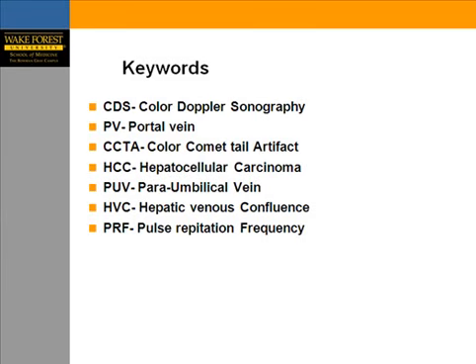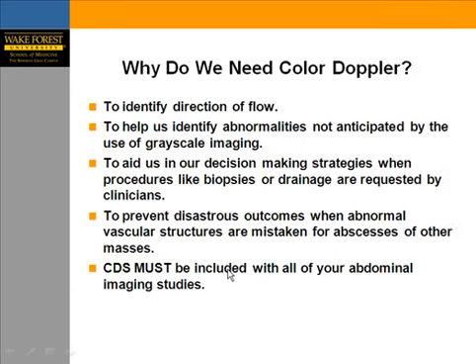All right, these are keywords to be familiar with before we start this lecture. I would like you to get familiar with the CDS. It stands for Color Doppler Sonography, and the CCTA, Color Comet Tail Artifact. The others are self-explanatory, and that should be easy for you to understand. So let's move on to the next slide.